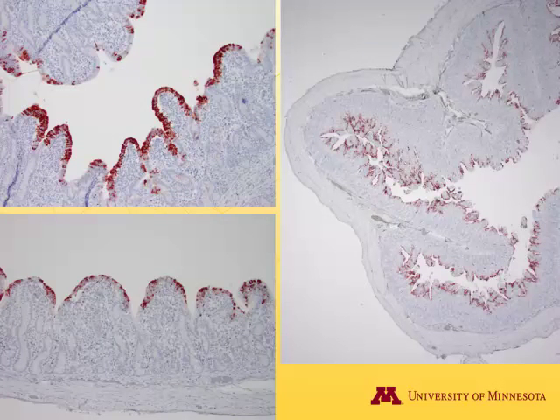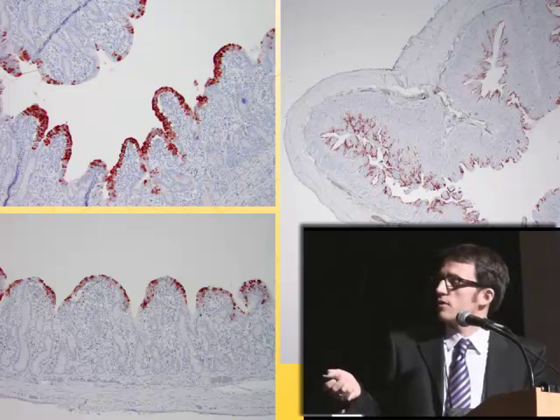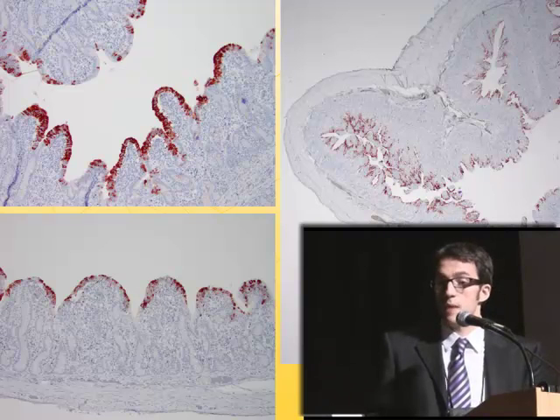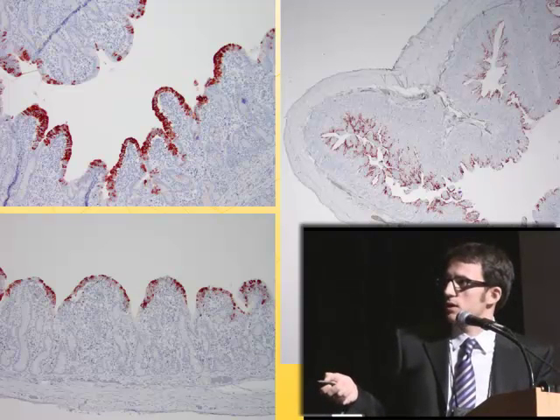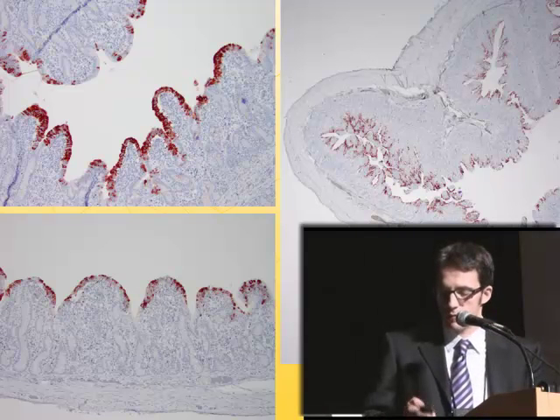When we put the antibody for PED onto these lesions, we see a lot of cells with a lot of staining for PED, and this correlates to what Dr. Dufresne was just saying about the amount of virus that we see in these cases. There's a lot of virus. For some other viral diseases, you would see just a few cells turning positive, and we would be happy with that to be able to diagnose viral diseases. With PED, this is what we're seeing. A lot of virus, and here is just another picture to show you that I wasn't just picking a pretty section. It's pretty much wherever you go, you're going to find a lot of virus in these severely affected pigs.